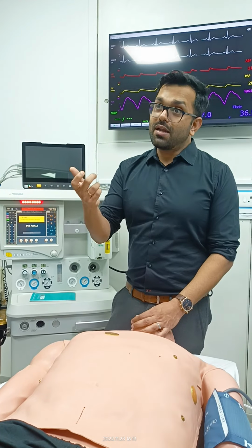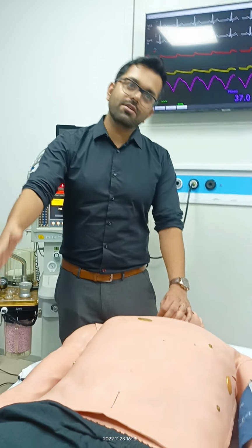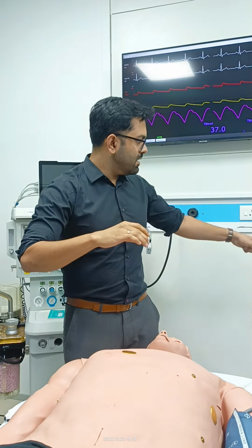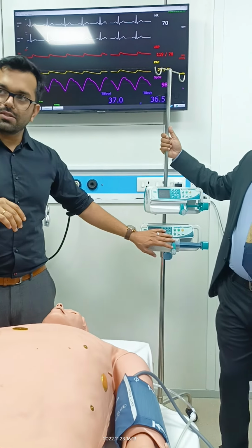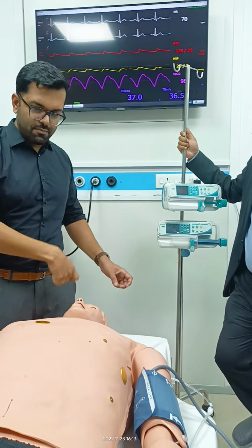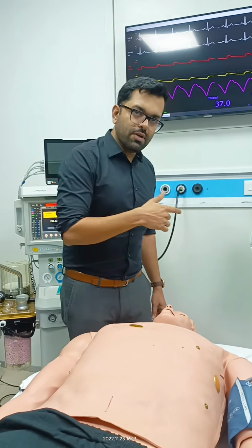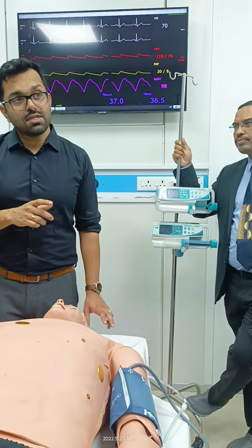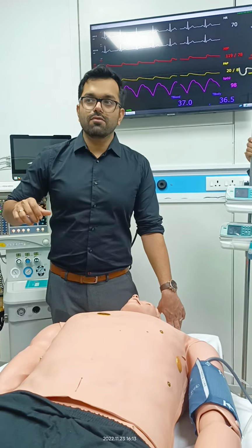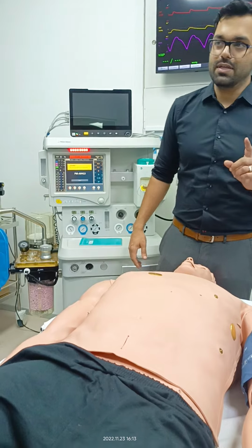If you're giving boluses at regular intervals, every 5 minutes, just imagine you are giving 10 cc every 5 minutes. So you need one person for that job only. Or you use, have you heard of infusion pumps? These are the infusion pumps in which you attach syringes, and once they are on, they inject the drug intravenously or wherever it is connected at a regular rate. So do we use that? There was a time when we were using boluses. Nowadays we have good inhalation agents, which can be used for maintenance of anesthesia.